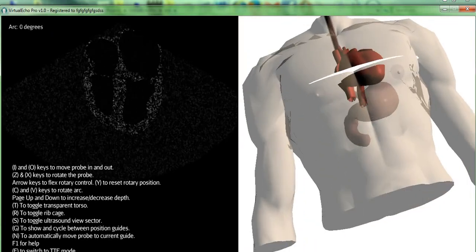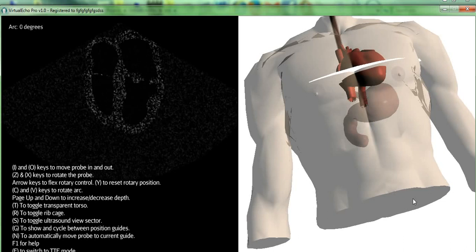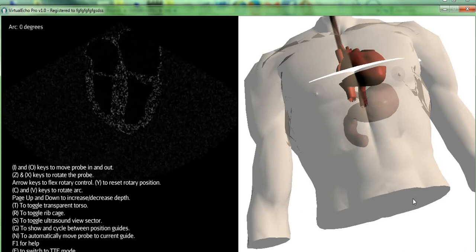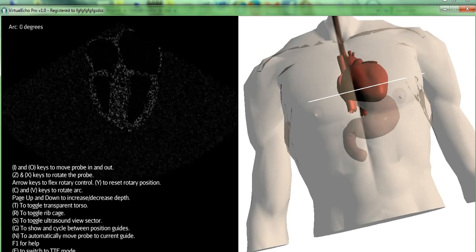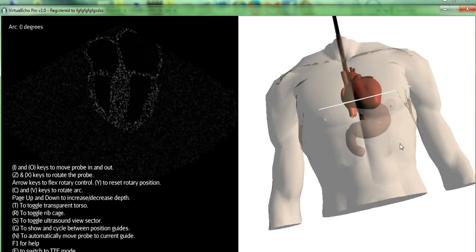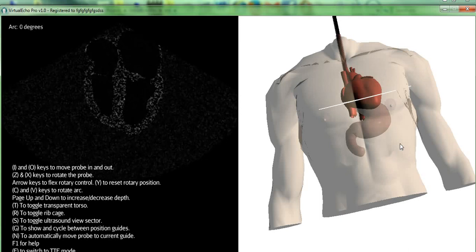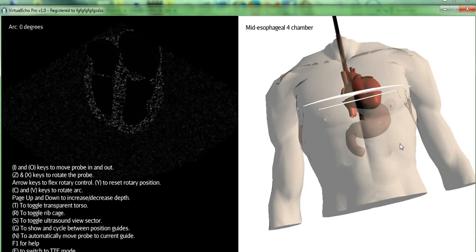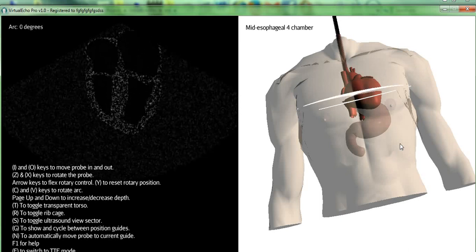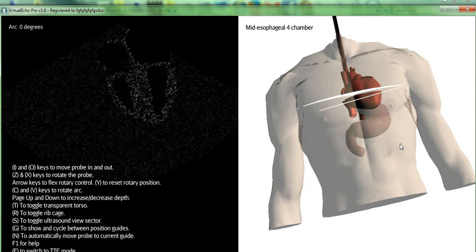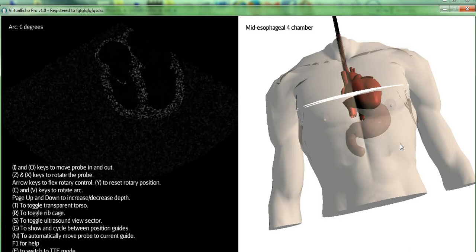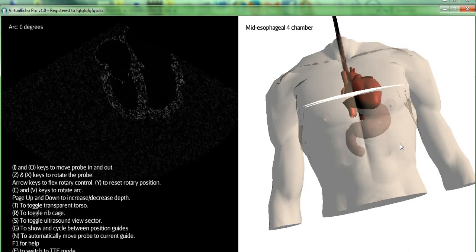As with the free edition, we again have some stored standard views that you can bring up using the G key. And pressing the N key will animate the movement of the probe until it obtains the desired view.